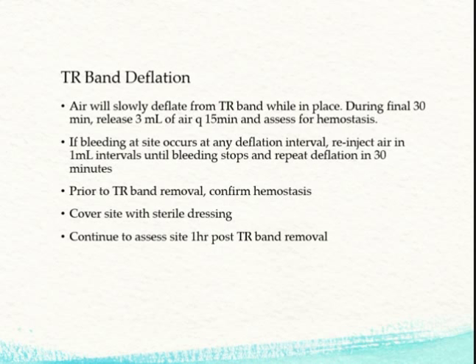Deflation: like I said, the TR band passively deflates on its own, but during the last 30 minutes, you're going to release 3 milliliters of air every 15 minutes. You're going to continue to assess the site, making sure hemostasis has been achieved.